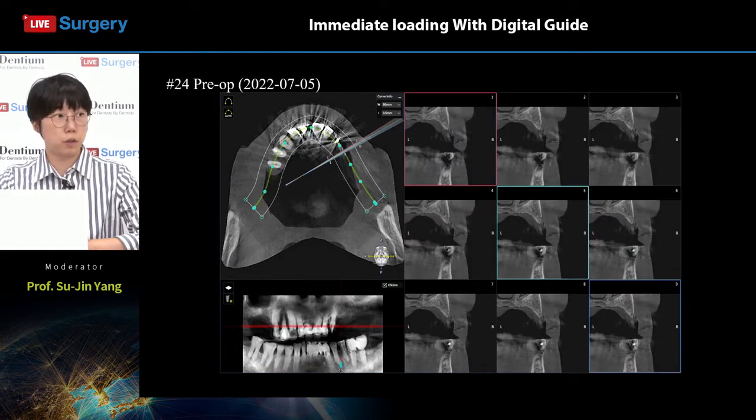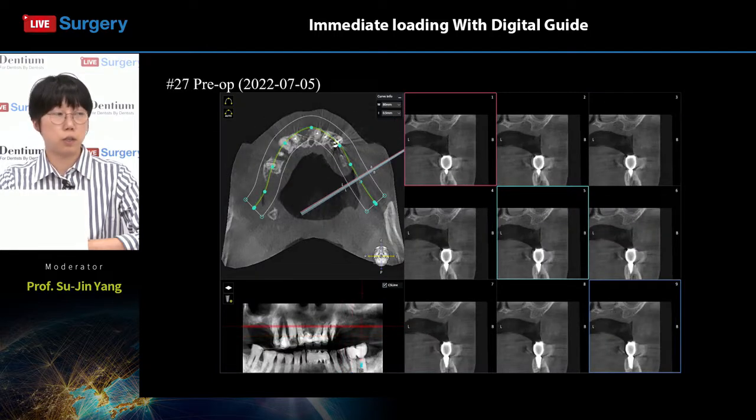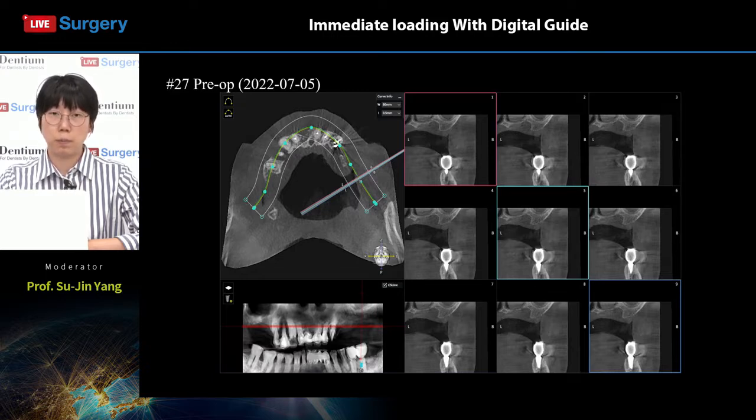Now, tooth number 24, 26, and 27 areas have sufficient bone with moderate height of approximately 8 millimeters, so we can assume no additional bone graft would be necessary. However, in cases where the implants are positioned deeper than the alveolar bone crest, a small amount of elevation of the sinus floor might be necessary, and since in cases where the implants are positioned too deeply, some interference can be present between the fixture and the healing abutment, some amount of bone preparation after the implant fixture placement may be necessary as well.